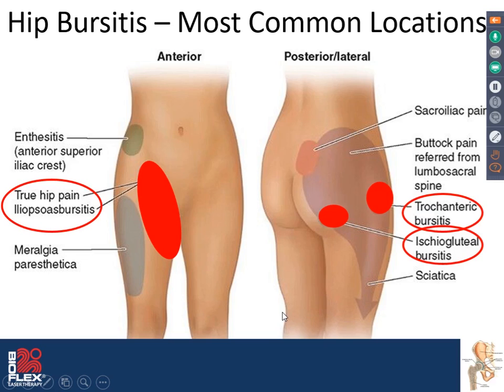When we approach treating bursitis around the hip, we're not going to use the entire hip protocol. You can use one or two placements with the hip protocol. You can even customize it to maybe reduce the amount of time, mainly because these bursa tend to be a bit more superficial. Well, at least a trochanteric bursa anyhow. The ischiogluteal and iliopsoas, you might want to stick with slightly longer treatment times as in the hip joint protocol. But you don't need to treat away from the area or all around the hip joint if it's a specific bursitis condition that you're dealing with.